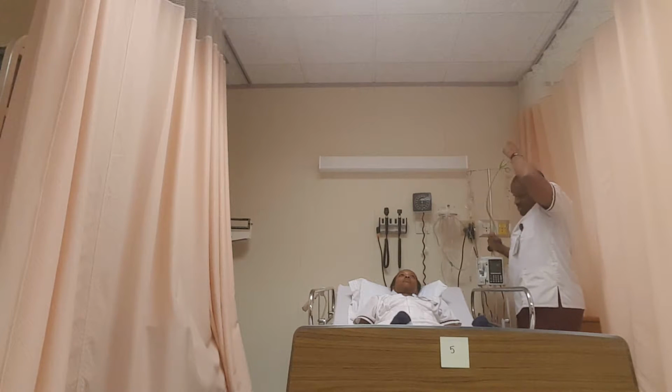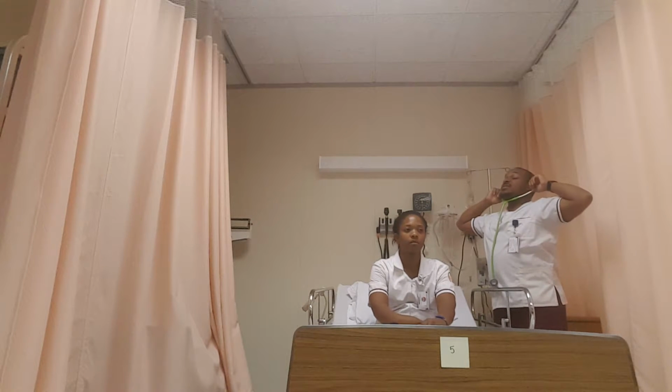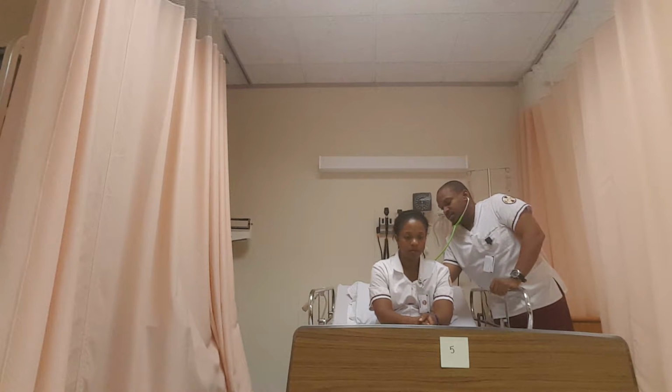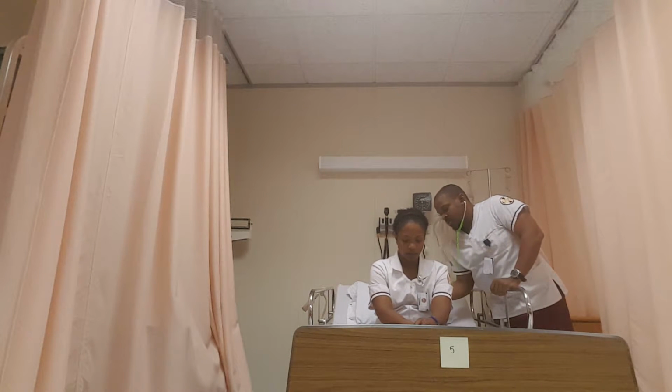Alright. Are you okay to sit up for me? Sure. At this time I'm going to listen to the posterior of the patient as well, just to check breath sounds. Make sure that they match with what I heard on the front. Alright, deep breath. Deep breath.